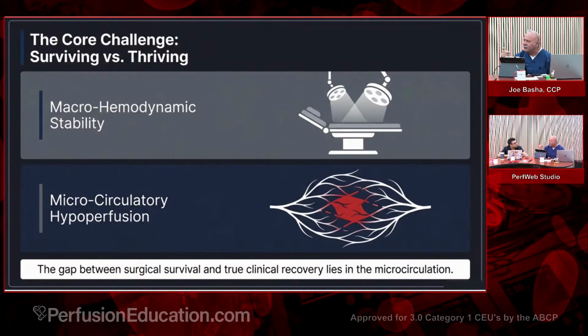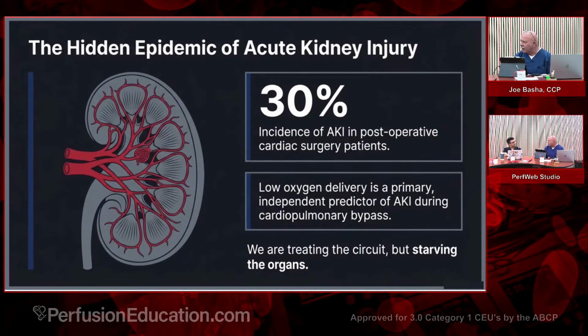But I think ultimately that's what saved us. Yeah, that's why this patient did so well. I think it would have been a totally different picture, especially if you don't have access to the type of fluids you need to do it. CVVH using a fluid like normal saline, even half normal saline, that you're loading with bicarb and dealing with hypernatremia, and trying to balance that and your bicarb up and down is a nightmare.